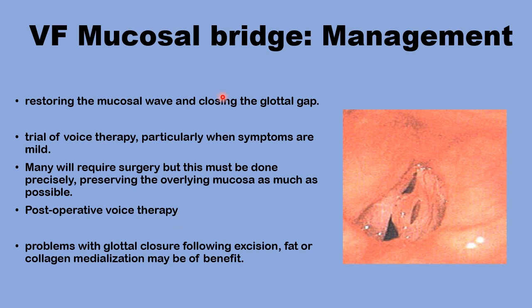The second focus is the glottic gap, and this can be sorted out after resection of the mucosal bridge by either fat injection or fat implantation, or using collagen rather than fat, or medialization procedures like type 1 thyroplasty.